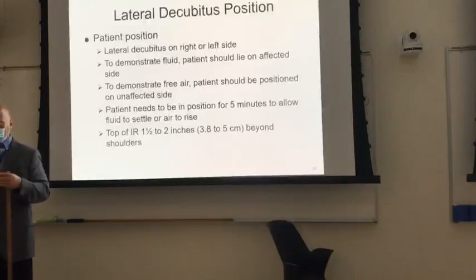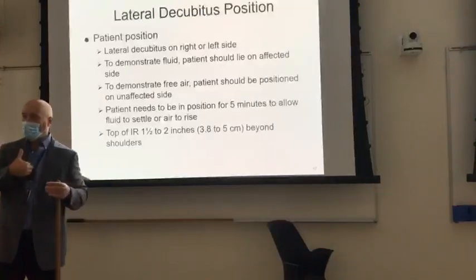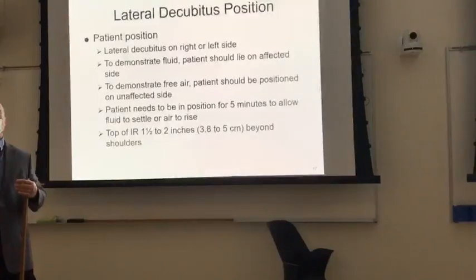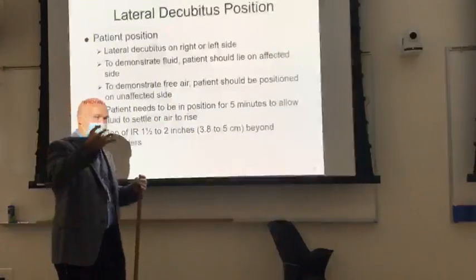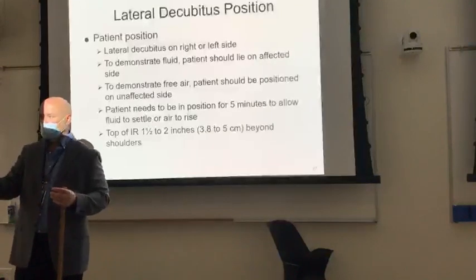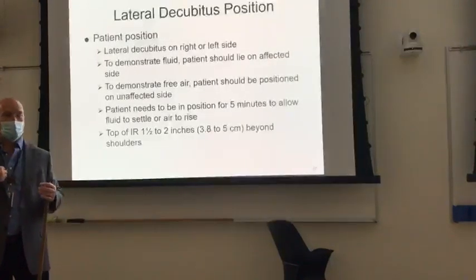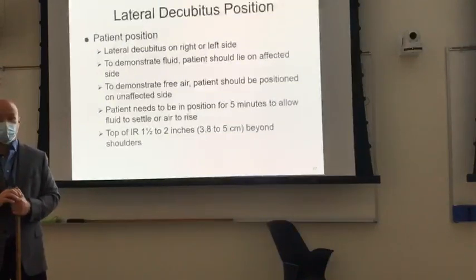It's just going to go to the left-hand side of the right pleura. Does that make sense? So more medial. What do we have that's more medial? The mediastinum. We have sternum, we have mediastinum, we have spine, we have heart, we have great vessels. How could you tell the difference between pleural effusion and all that other liquid-filled stuff? It's a trick question. You cannot.